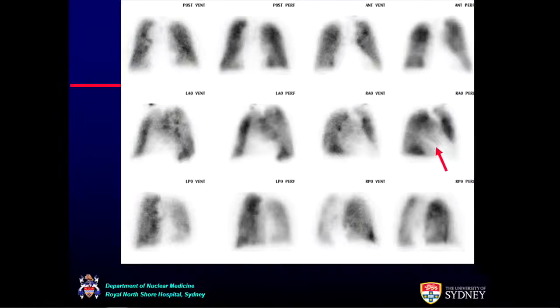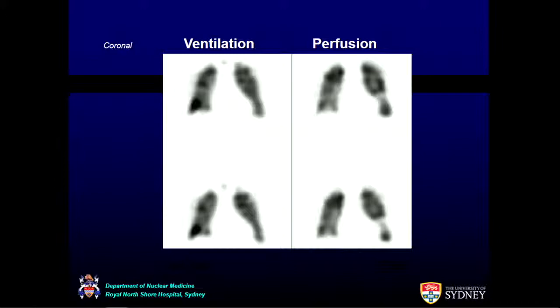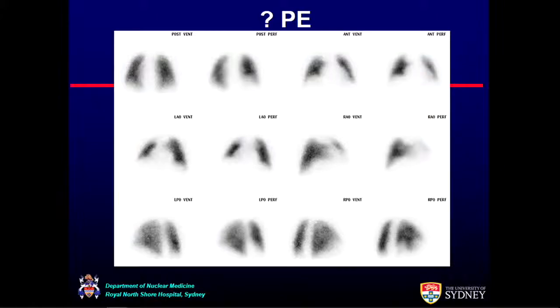Again, probably not a lot. Have a look at that area up there, though. A little bit down, maybe. But again, once you have the SPECT, you actually got the lingular out here. And the reason you don't see it is because of this overlap. So it's not just at the subsegmental level you're picking up clots, you're also picking them up much bigger.